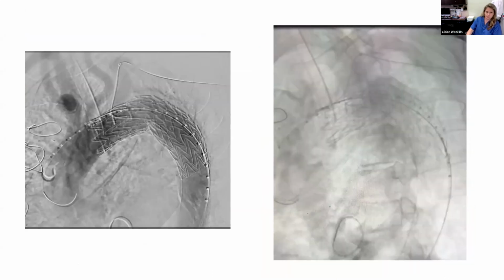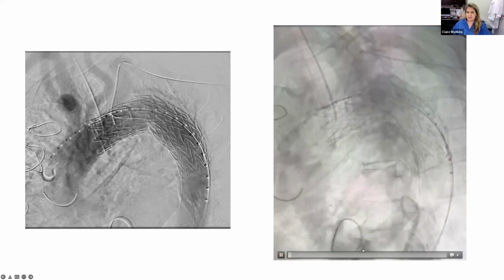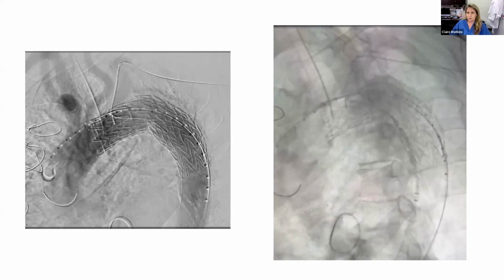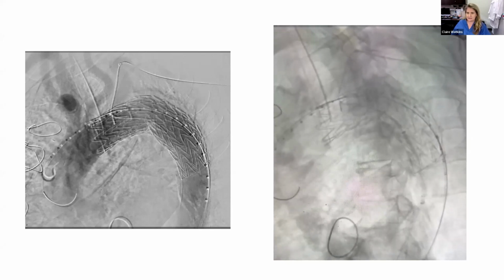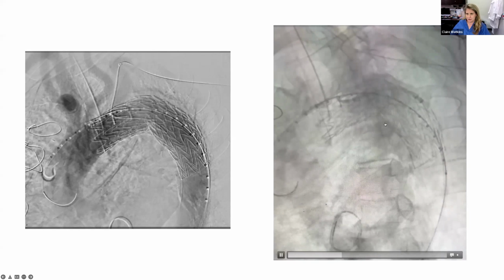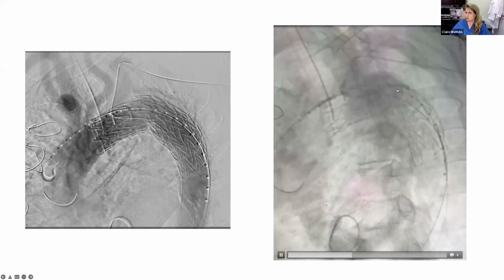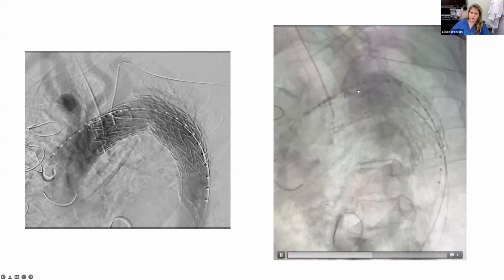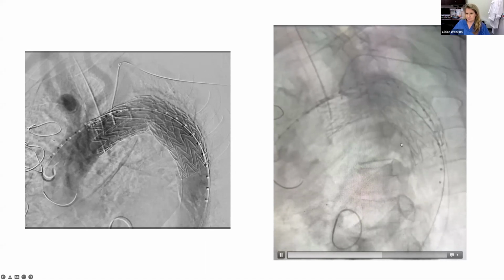Next, we deployed our device with this radio-opaque band right here, our fabric, right as close to the left carotid as we can. And then deliver the side branch from below over the through and through wire. Again, watching right here as you pass into the portal that you don't distort it, and again, pulling taut to help it get through there. You can see we have a little trouble getting it, and that's because there's too much redundancy on this through and through wire, and the person at the groin isn't pulling tight enough. When they do, the side branch tracks nicely up where it's supposed to go.